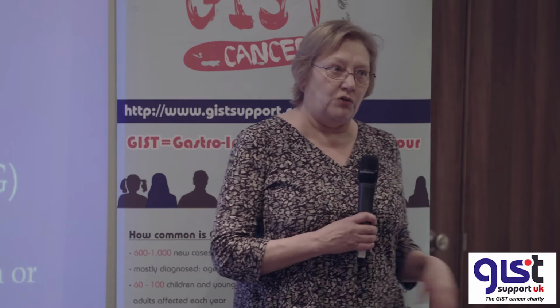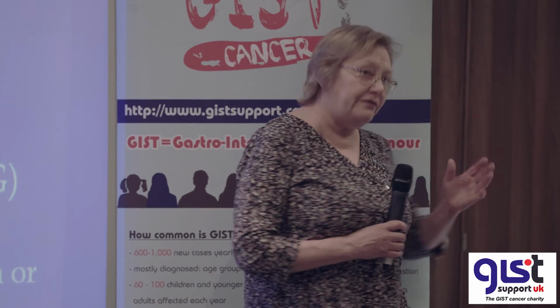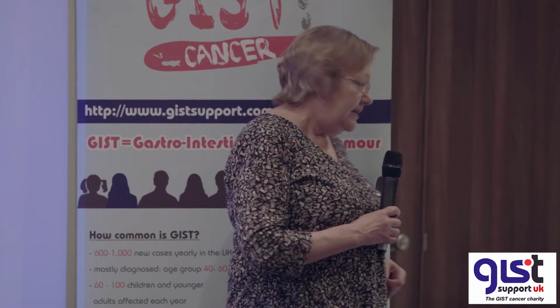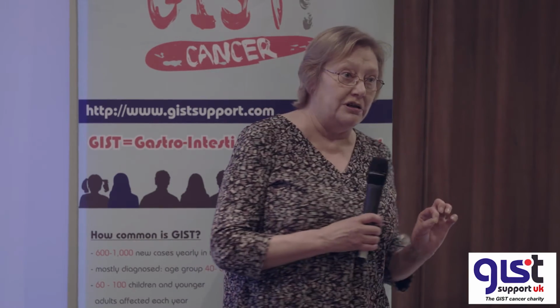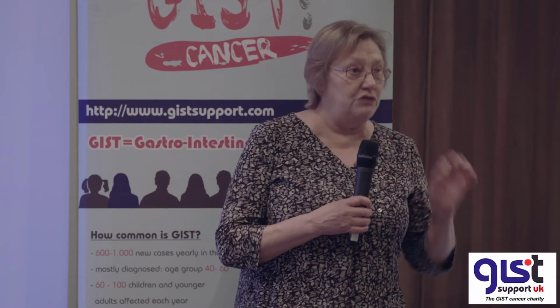Just to go through what a PET scan is, it stands for positron emission tomography. It's a nuclear medicine technique, usually fused with a CT image, so the CT image tells you anatomically where you are. It involves an injection of glucose which is labelled with some radioactive fluorine. It's fluorodeoxyglucose. It's got a very short half-life, doesn't last very long. And because it's glucose, it goes to areas in the body that are using a lot of energy, using a lot of the sugar. Sometimes they call it hot sugar.